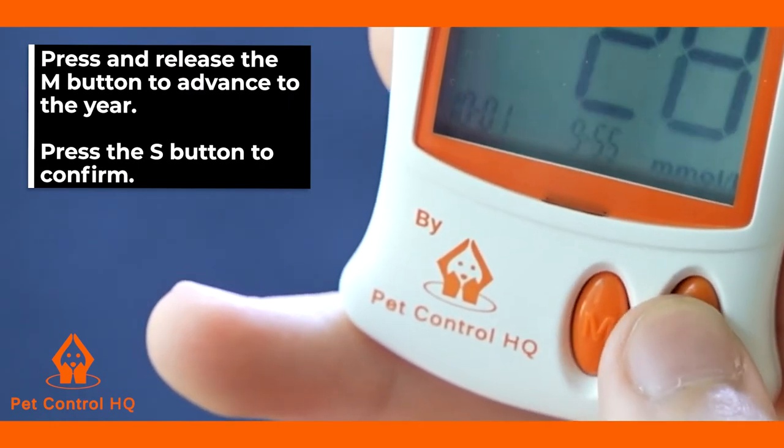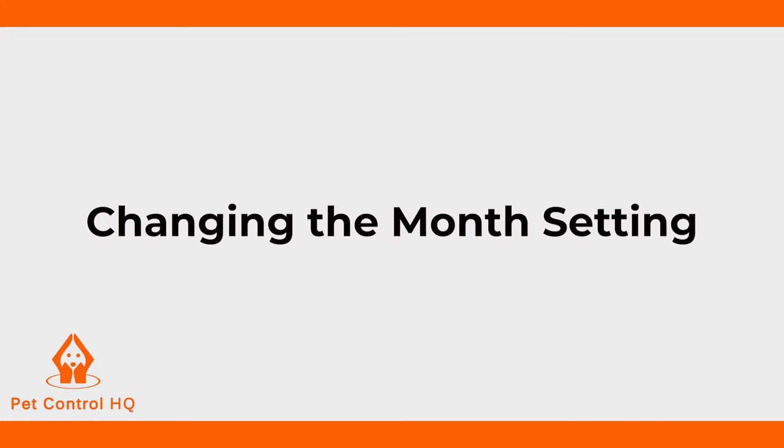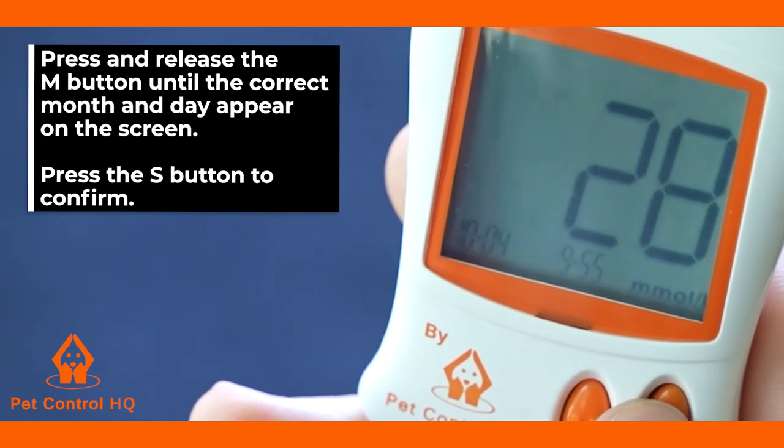The month setting will then be displayed on your monitor screen. To change the month setting, press and release the M button until the correct month and day appear on your screen.